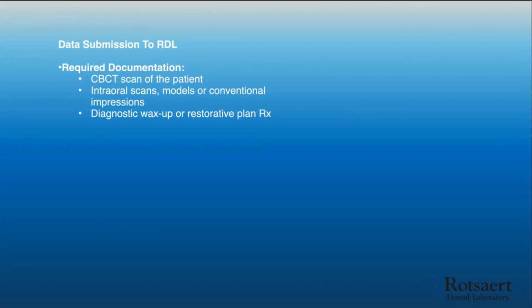We'll also do a diagnostic wax up, and then the restorative plan, of course, which is communication back and forth, usually via email, so that I have all the information. But I'll ask you what your plan is and what your surgical kit is, right? What are you using? What system? And it's important because in Exoplan, just like any of the others, they're only as good as the information that the implant companies provide to us.